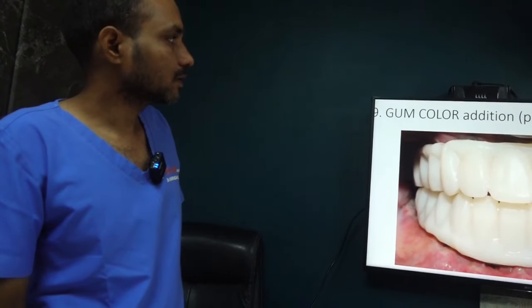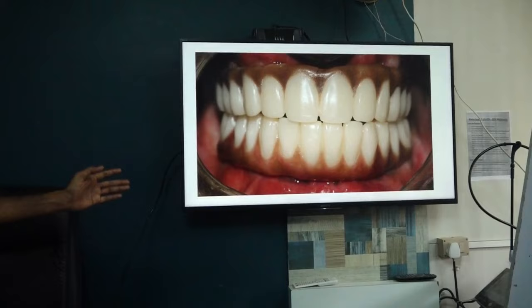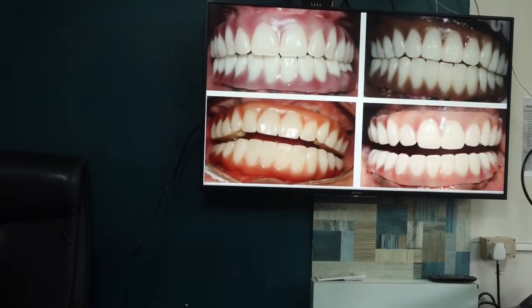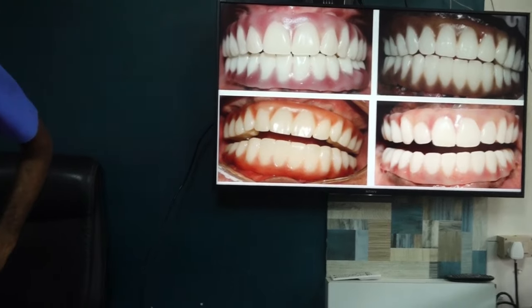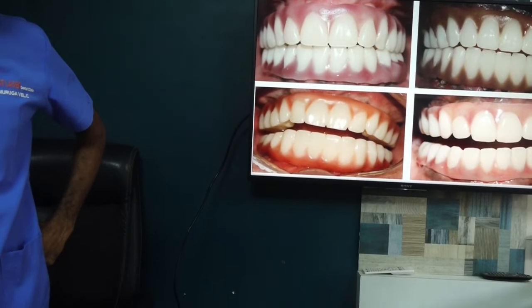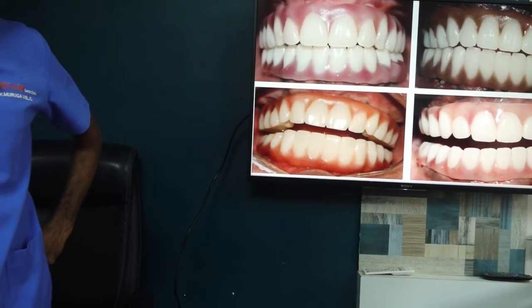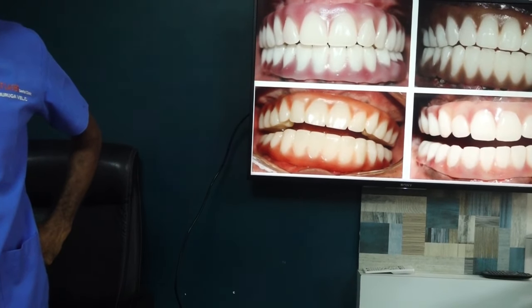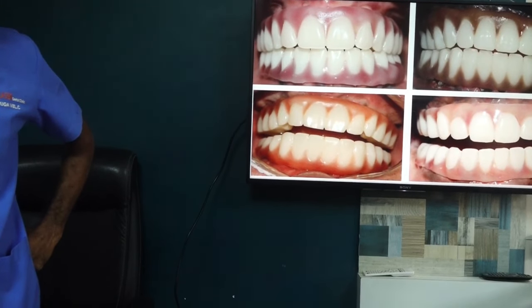Okay, next one. So adding gum color. There are 4 colors available. It matches the patient's gum very well. We give whichever color matches the patient. For a foreign patient the gum is rose color inside. When the gum color matches, when they smile, the papilla zone and the lip show naturally.